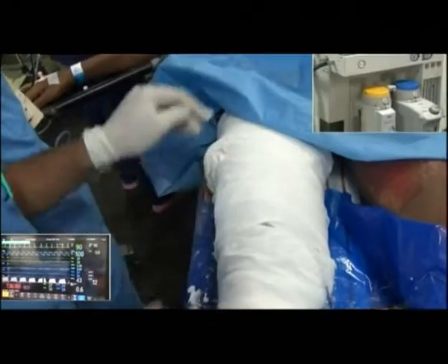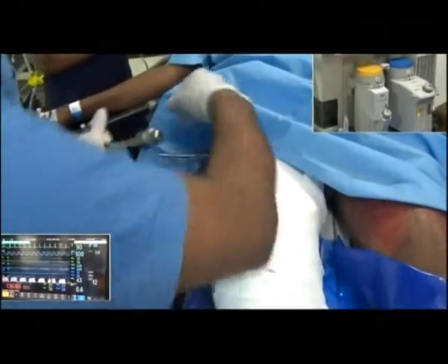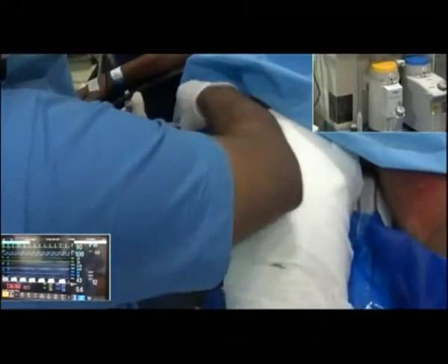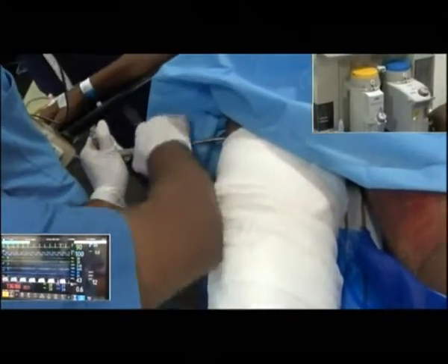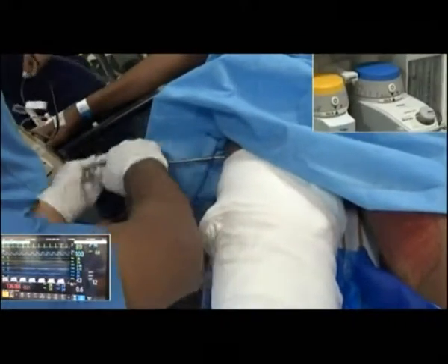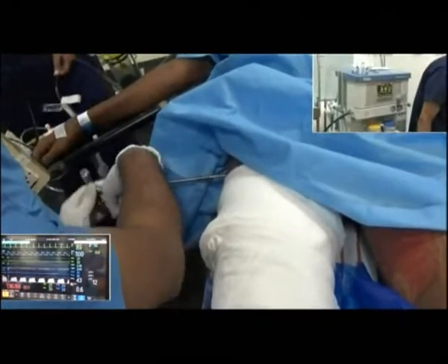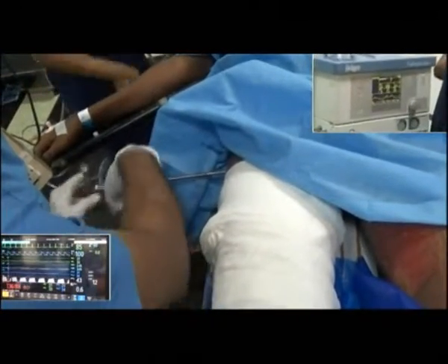The blood gas coefficient of nitrous and desflurane are similar. And yes, off nitrous. And increase your flows to 10 liters, 8 to 10 liters per minute. Maintain the ventilation so that your aim is to wash off the inhaled anesthetic. Let's look at the twitches. How many twitches does he have?